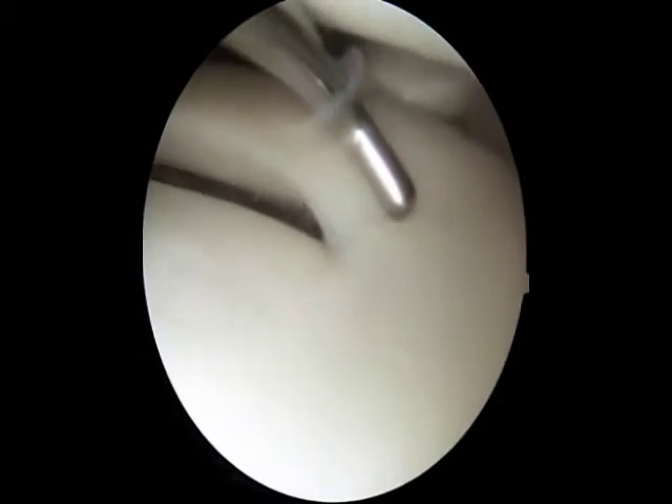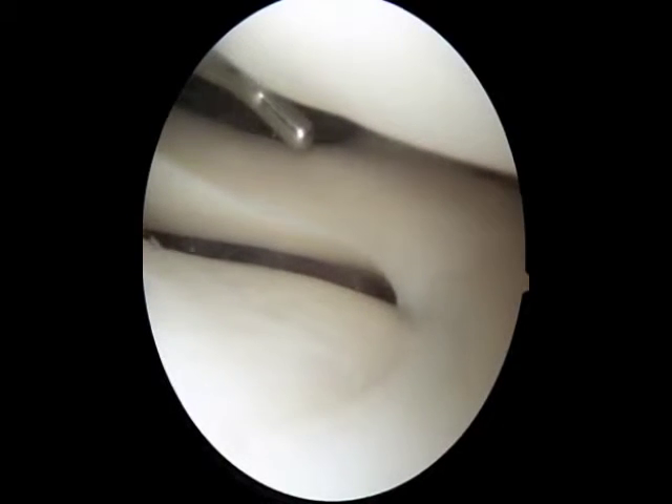The surface of the bone is then probed and we can see here some minor softening of the tibia at the bottom of the screen.